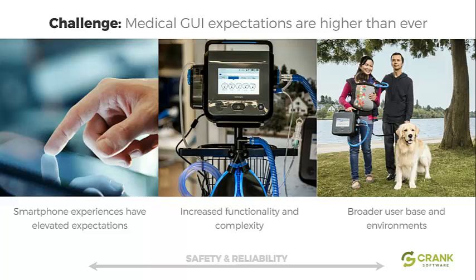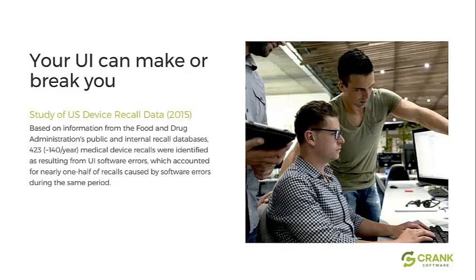This is just an interesting data set I found, and I've heard about it for a long time, but it's from 2015. It talks about how much the UI matters. Coming from a company that sells user interface tools, I understand that in medical devices we are not the primary usage of the device. It's a ventilator, it's a blood test, whatever it might be. There's a primary focus that's beyond us. It's not just a touch screen for people to play games on.